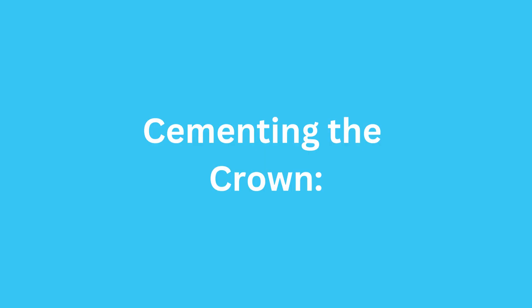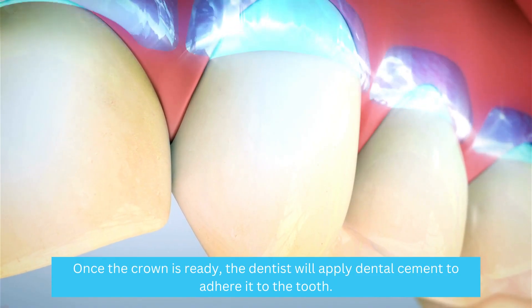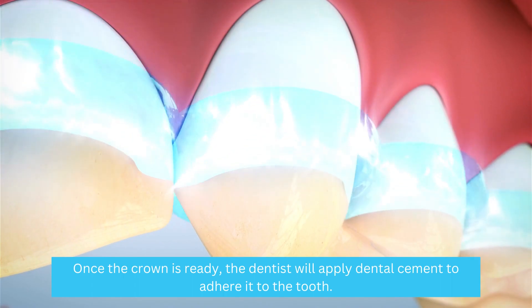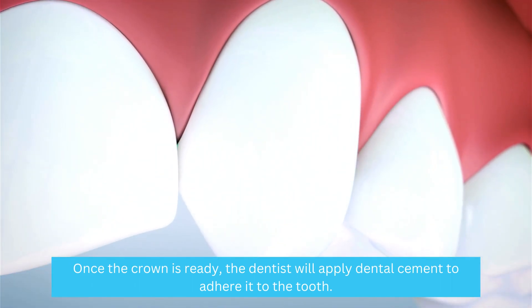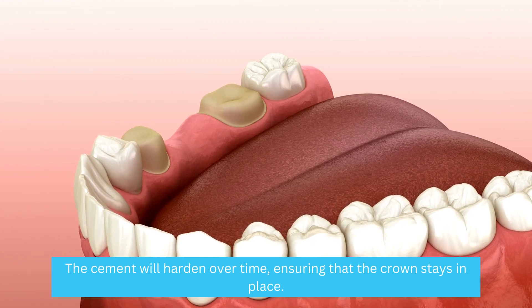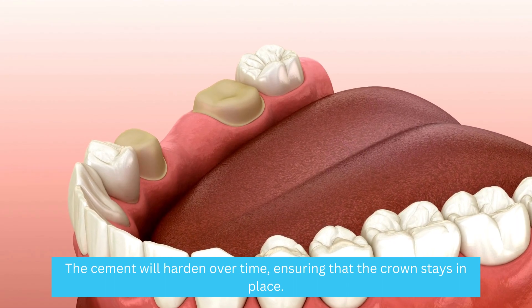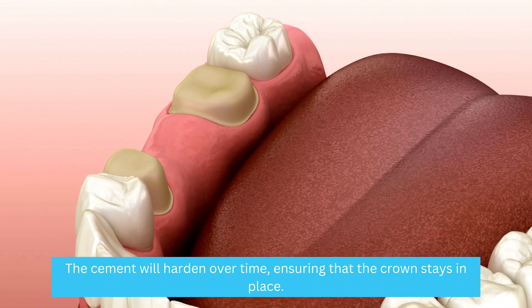Cementing the crown. Once the crown is ready, the dentist will apply dental cement to adhere it to the tooth. The cement will harden over time, ensuring that the crown stays in place.